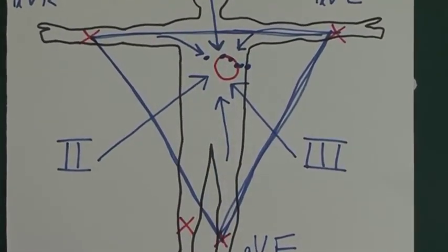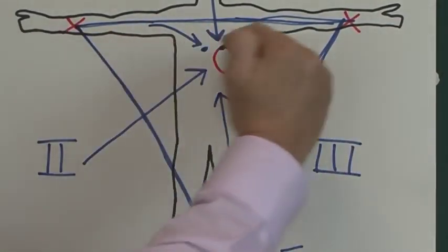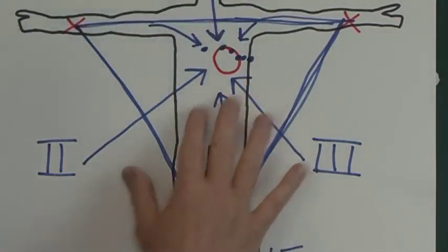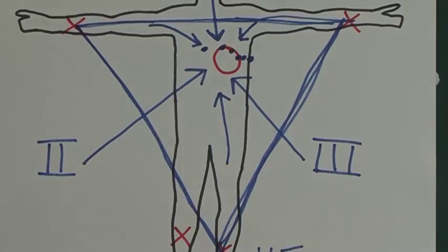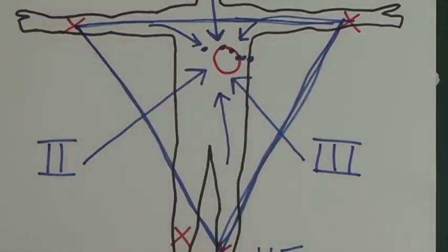And these are looking at the heart from a plane going around the heart that way. So these ones, 1, 2, 3, AVR, AVL, AVF, are looking at the heart in this direction, in this plane. The chest electrodes, V1, 2, 3, 4, 5 and 6, are looking at it in this plane. So we've got a lot of positional information about the heart here.